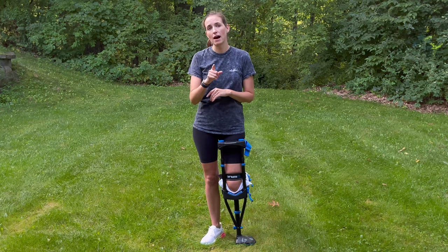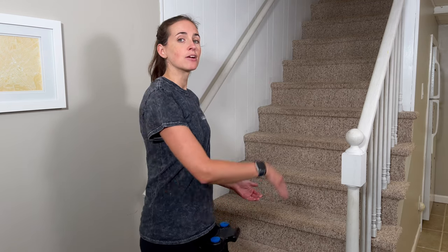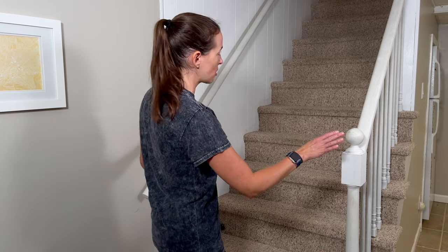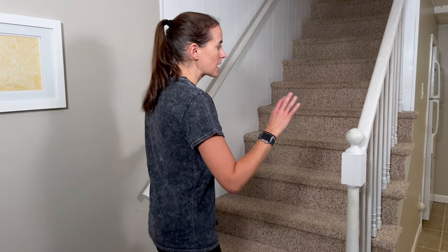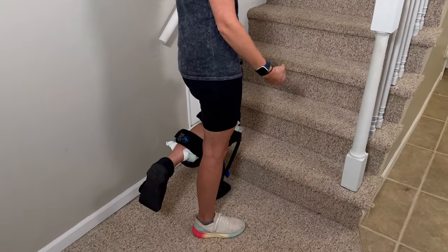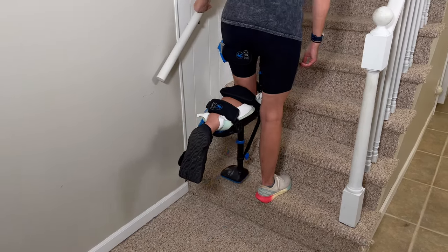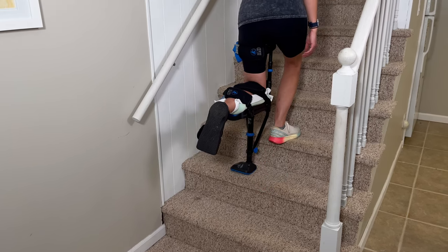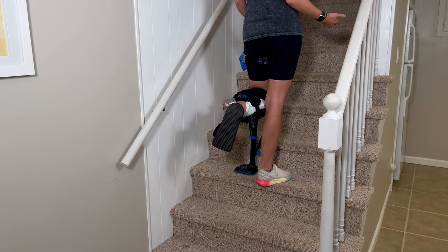Now I'll show you the other reason I loved the iWalk — doing steps. When ascending stairs, you face the stairs, and it's so much easier with a handrail available, though you can manage with a cane or using the wall for balance. To go up, your non-injured foot ascends first — up with the good leg, then follow through with the iWalk. Don't try to skip a step, it's too dangerous. Take your time — and I could carry something while doing this, which was really nice.